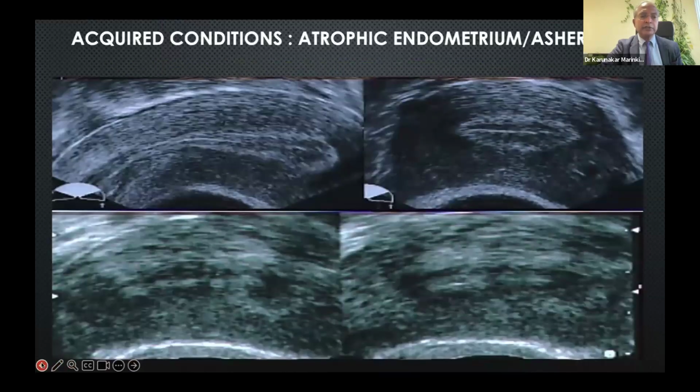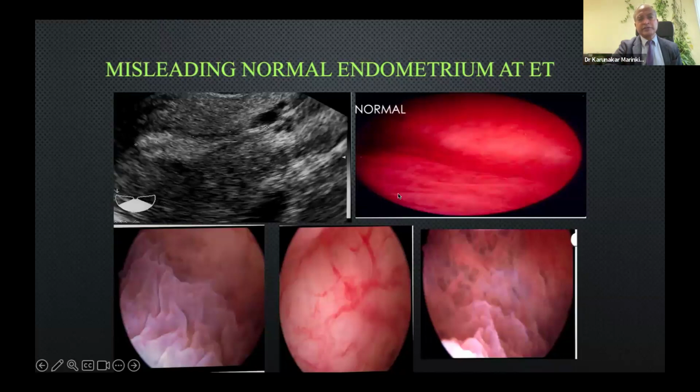What is the correlation between hysteroscopy? As I said before, I have a separate presentation. The correlation between ultrasound, contrast ultrasound, and hysteroscopy, I have the world's second largest data, including histology. A beautiful luteal phase endometrium, I expected hysteroscopy like this, but she had 3 pathologies, which means if I claim that by using ultrasound alone, I will get a 70 to 90% pregnancy rate in my clinic, I'm bluffing to myself.